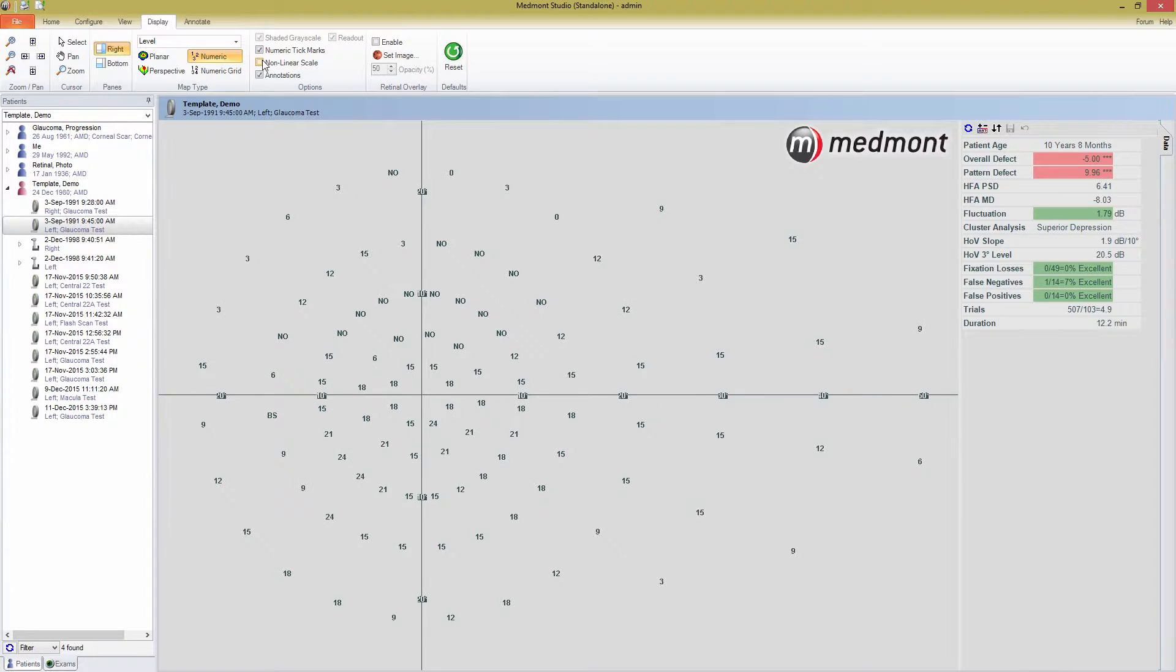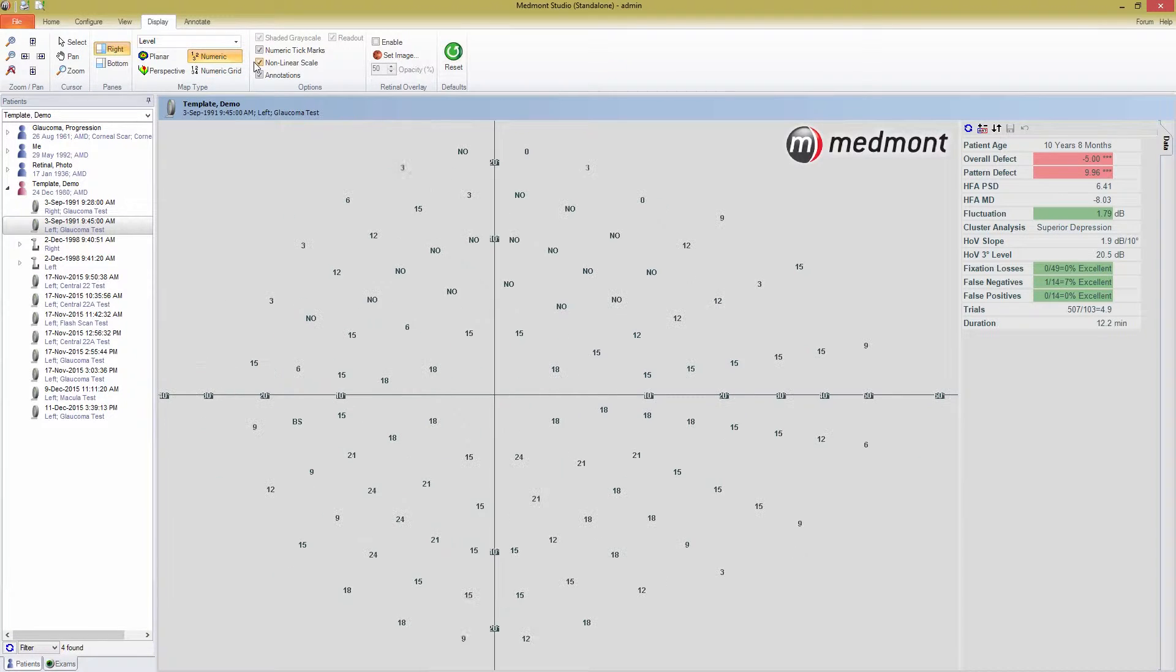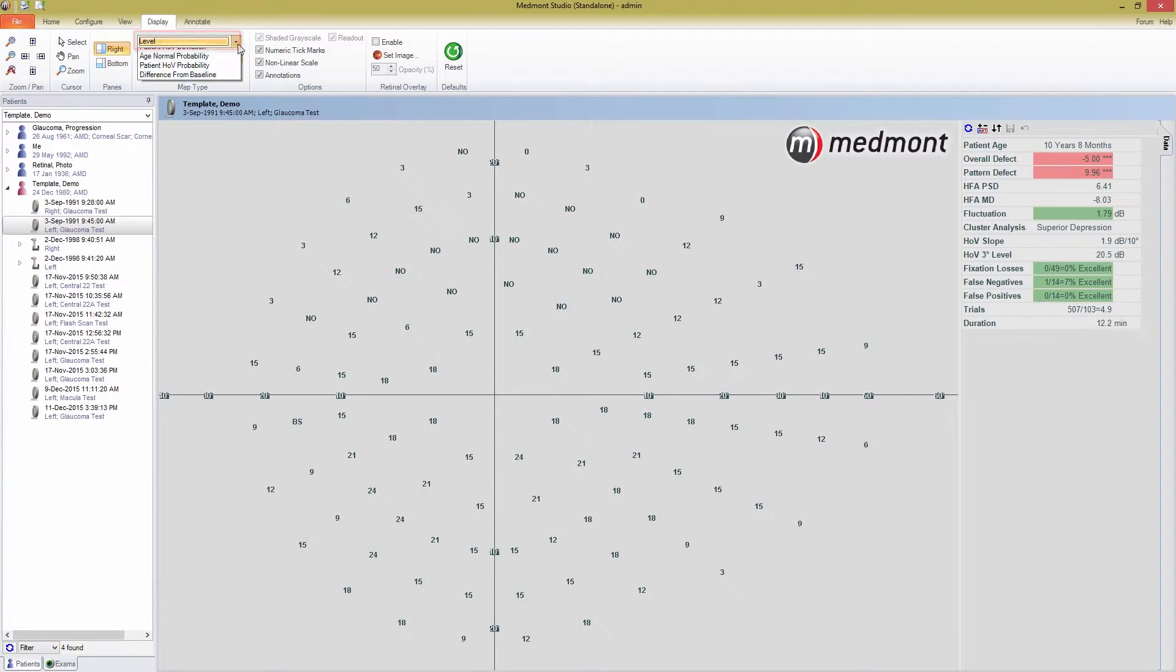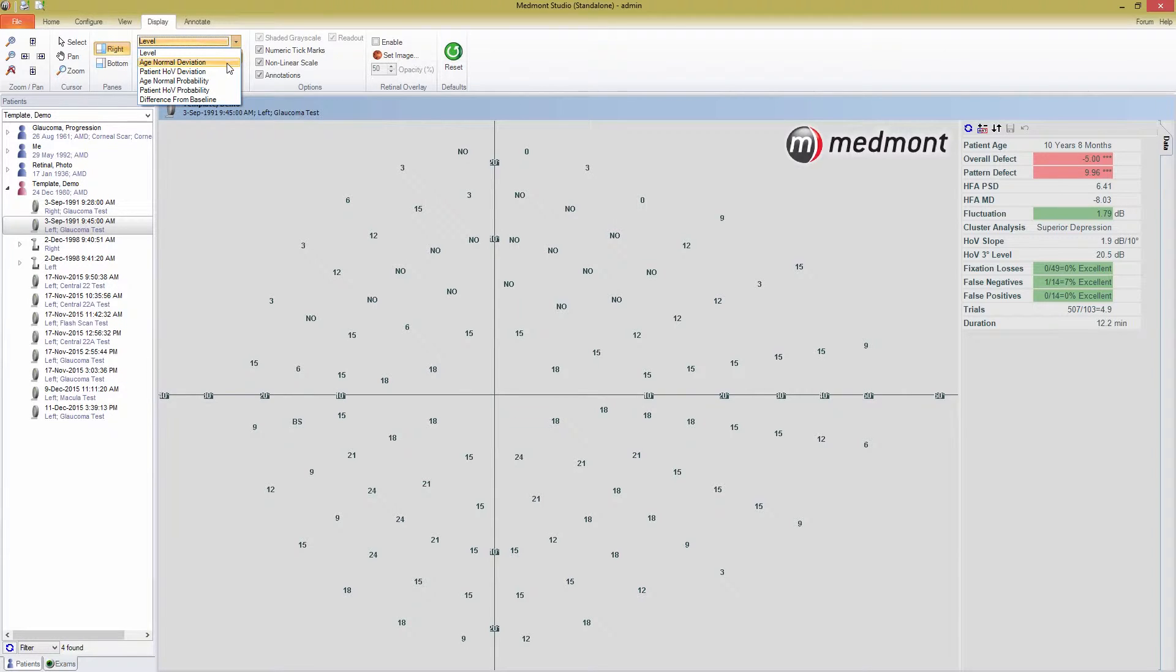So far, we've been looking at this map using the levels display. This shows the data as the raw threshold values in decibels. If you press on the drop-down menu in the map type section, you're faced with a number of other display options. Let's start with age normal deviation.